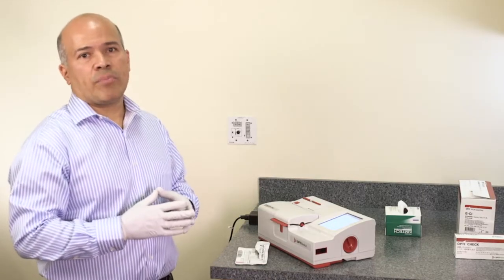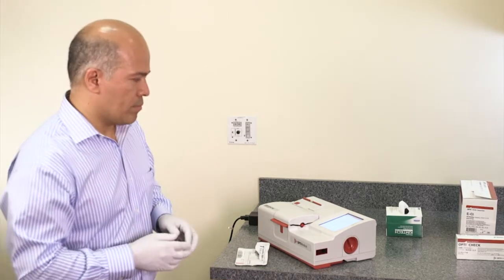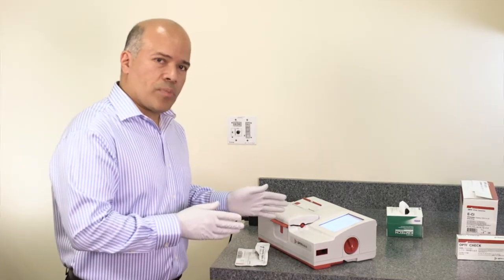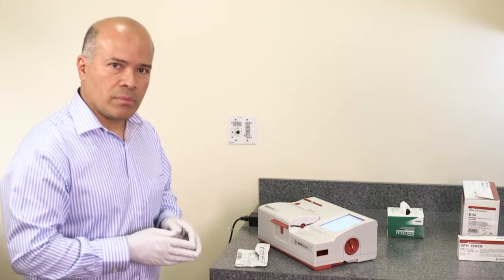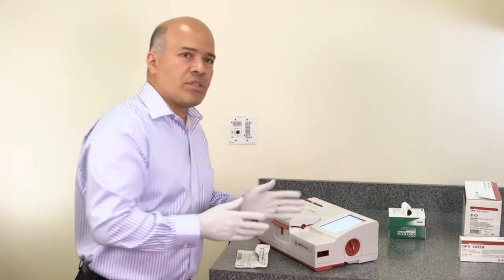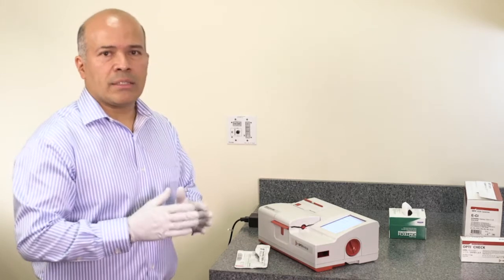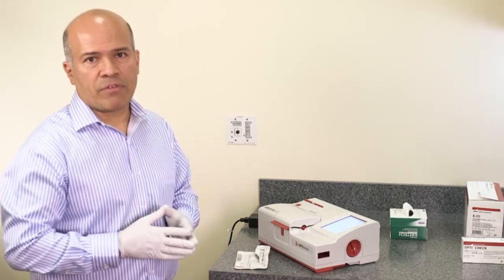At this point, the analyzer begins the cassette calibration for validation of the cassette. Also at this point, the user can enter the patient information by going to the patient information menu to enter patient ID, sample type, sex, and many other patient details.